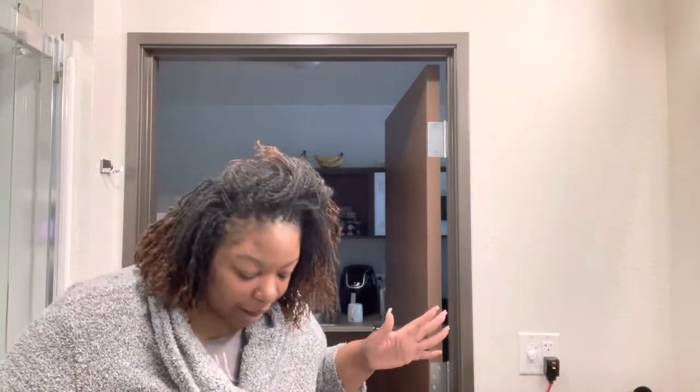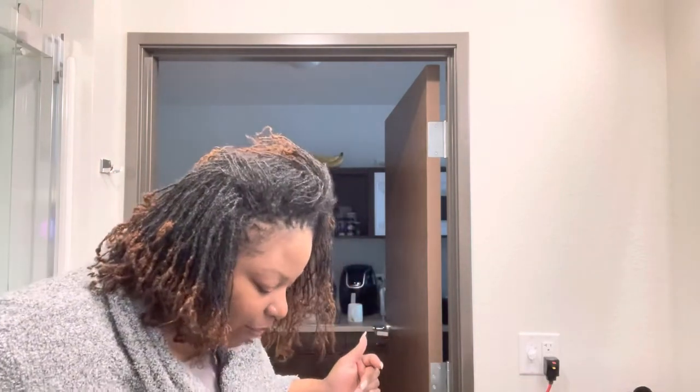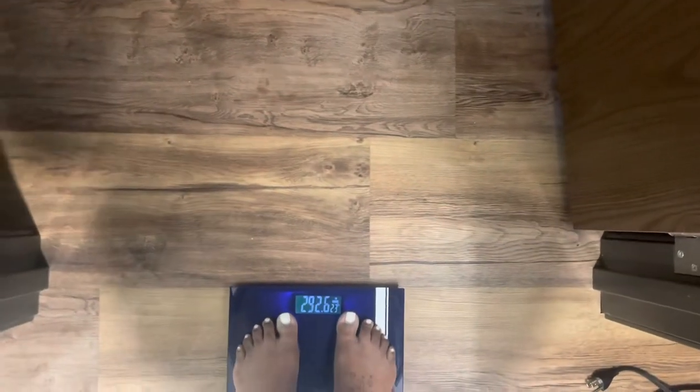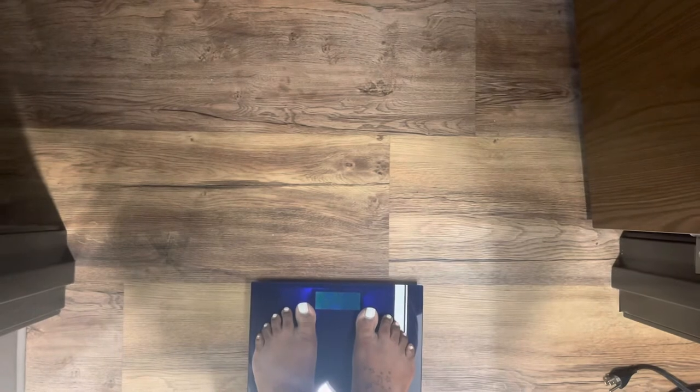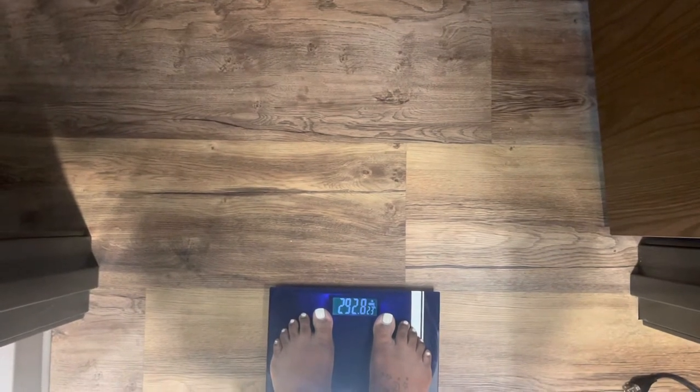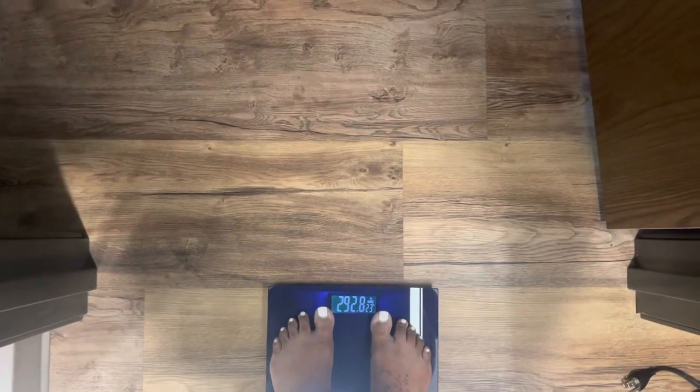Let the games begin. I'm scared to get on this scale, but I'm about to take off my robe — I don't have any clothes on underneath. Y'all are gonna see my ashy toes because I didn't put any lotion on last night after my shower. We are about to get on the scale and see the damage that's done. Okay, you've seen the numbers — and that is crazy.